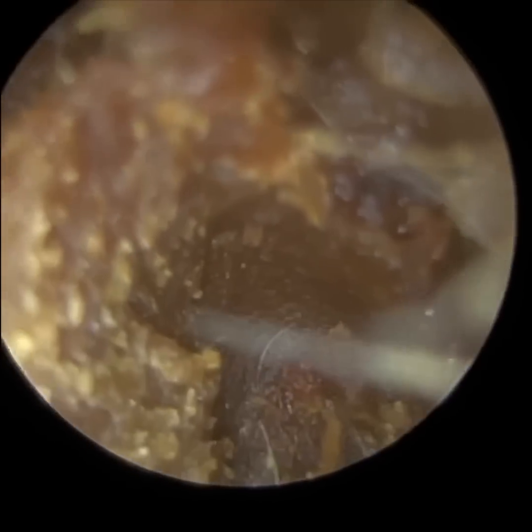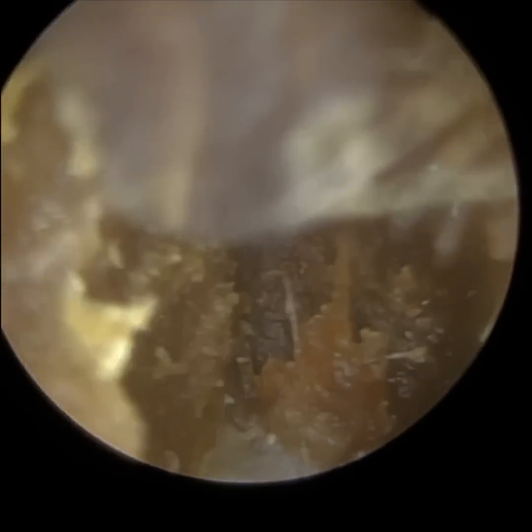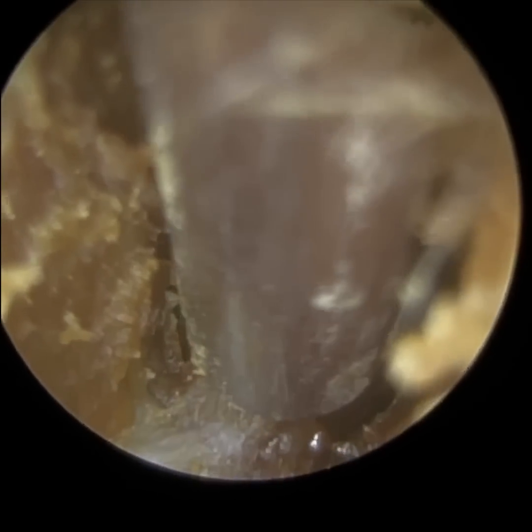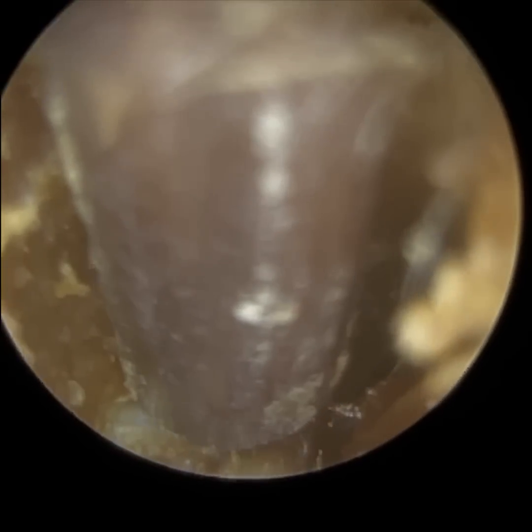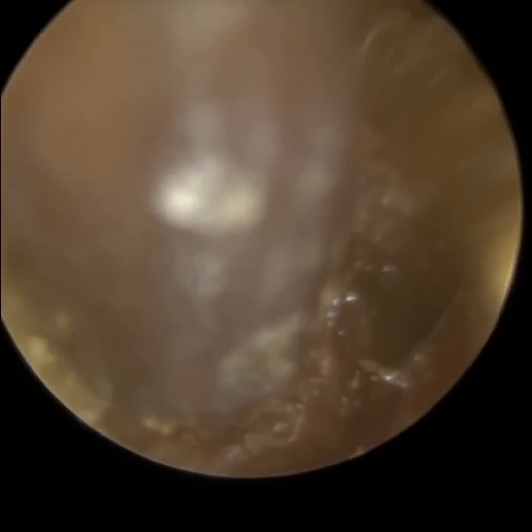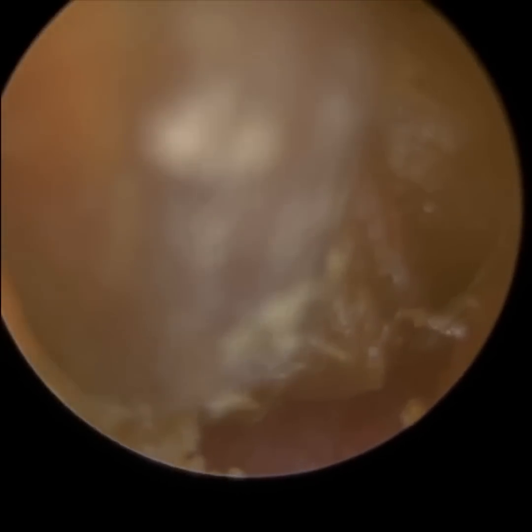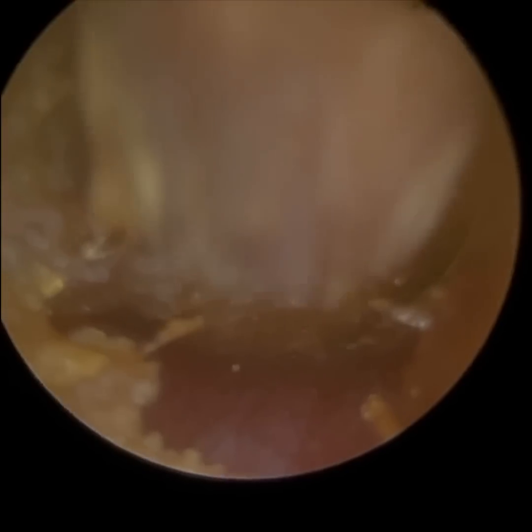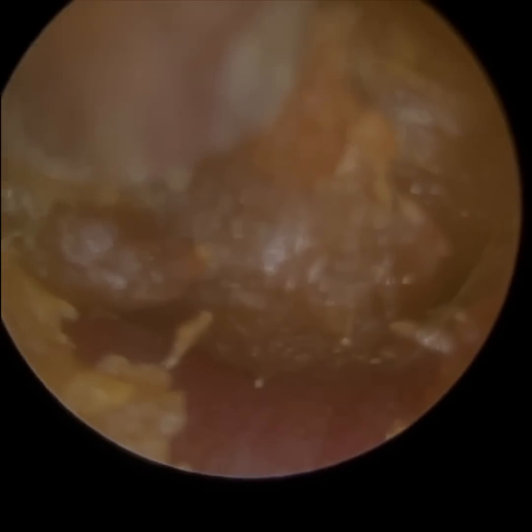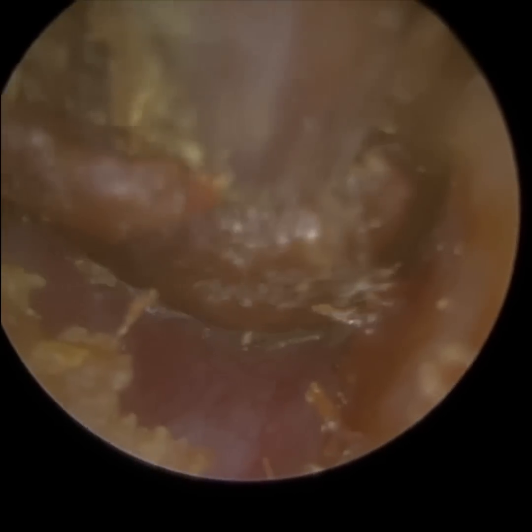Other notes I sometimes make for other patients, for example, if they've got a really hairy ear, it can obscure the view, so I document that. Patients with very hairy ears, I try to avoid or minimise the use of any olive oil drops, if at all possible, sodium bicarbonate drops, whichever drops I'm using. That's because as you instill these drops into the ear, they coat the hair strands, and when you insert the endoscope into the ear, inevitably it's going to be in close proximity to these hair strands, and if a particular hair strand is greasy and oily, it can smear the lens of the tip of the endoscope. So it's just another possible note.